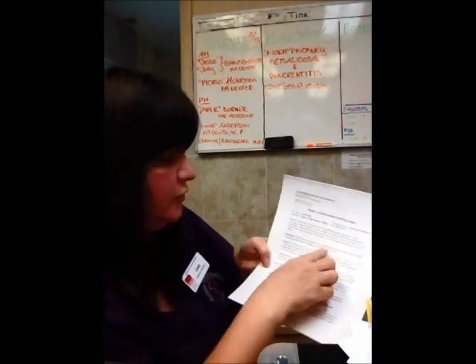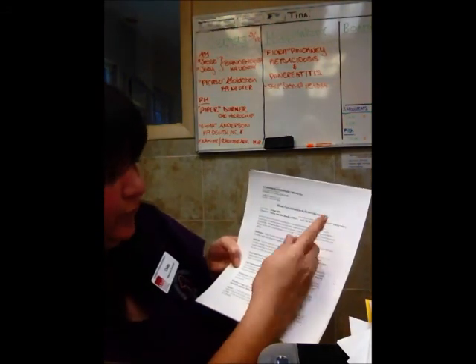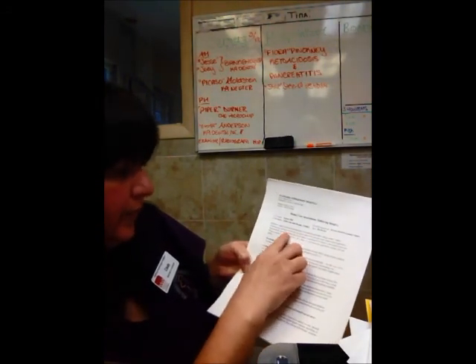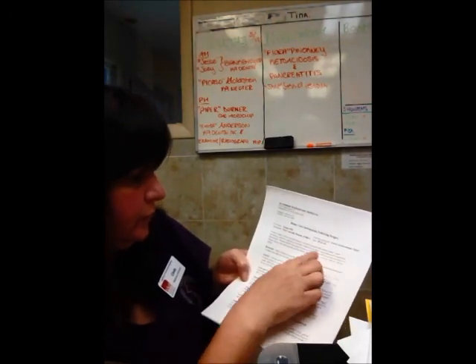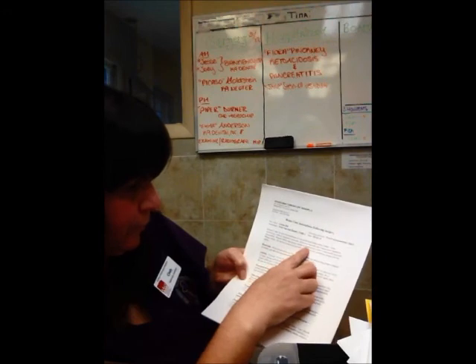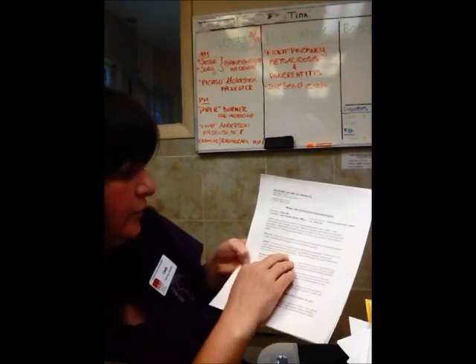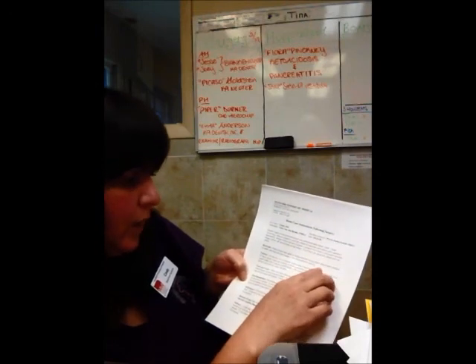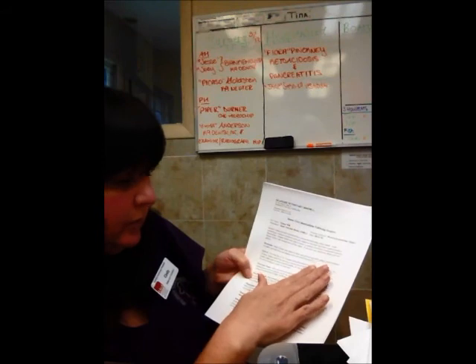This one is for a spay. So we have the ovariohysterectomy was performed. We use a laser here. So we talk about how the technology reduces trauma, improves recovery, and reduces postoperative discomfort. Proper follow-up care is essential for successful recovery. We talk about restraint and staying quiet and loving while using proper restraint to make sure she doesn't engage in too much physical activity.